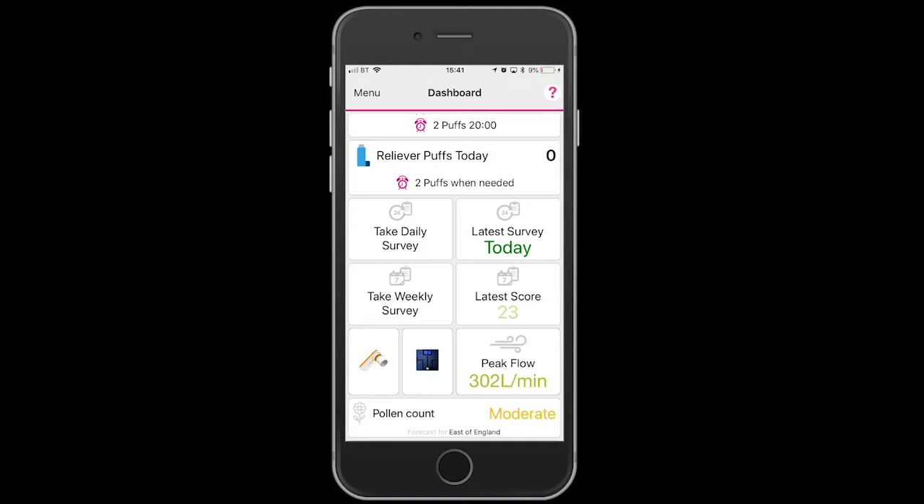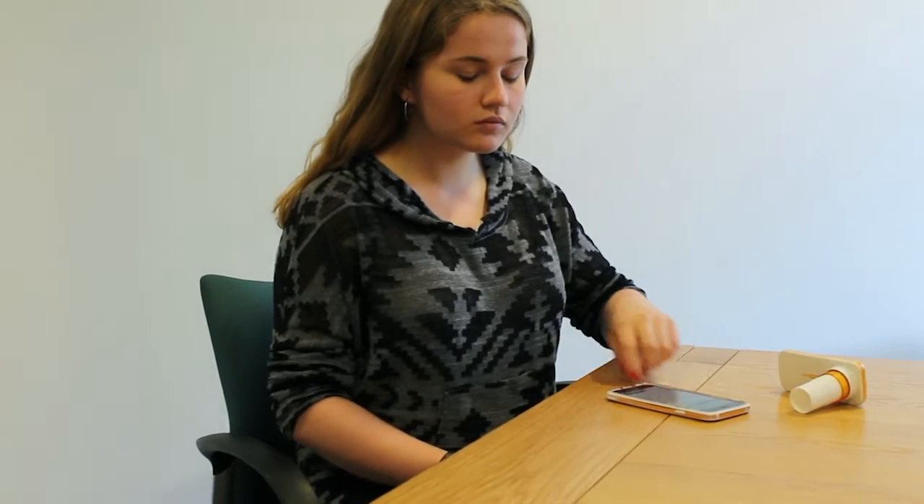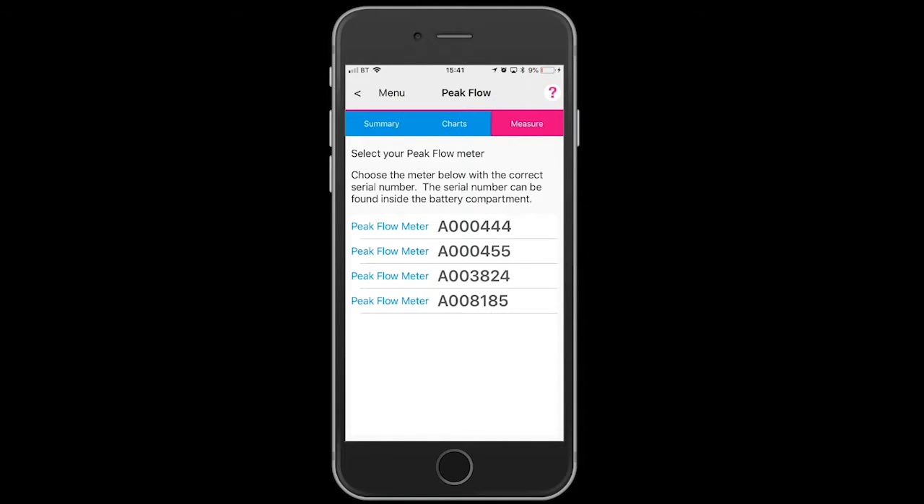To take a peak flow reading, open the app and touch the image of the peak flow meter on the dashboard. Identify yours by its serial number.